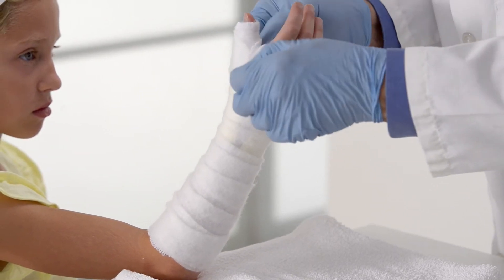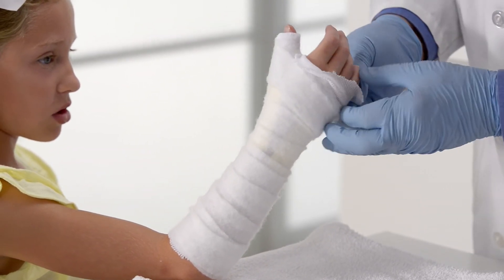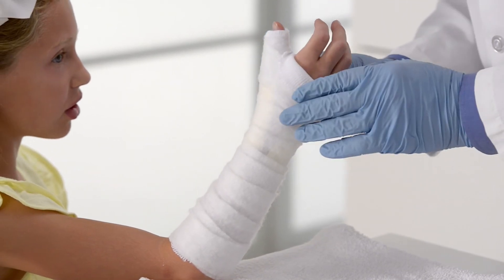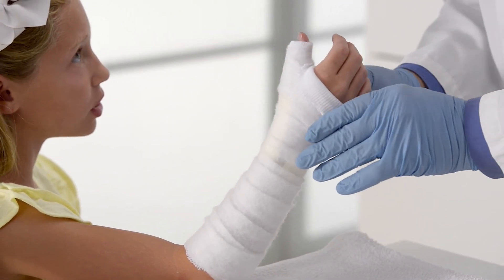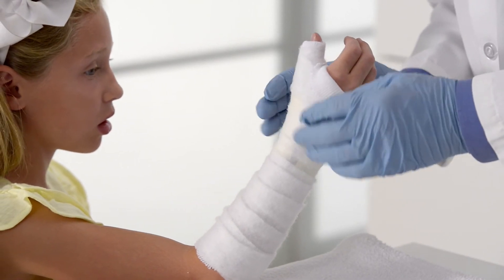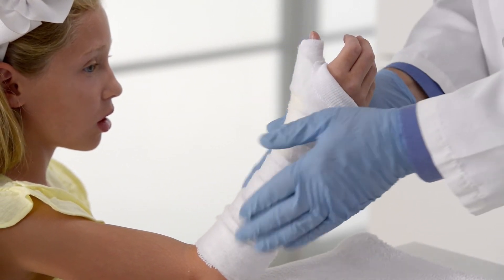Fold the stockinette back over the padding at the distal palmar crease. Confirm that the patient's arm is in the proper position. The wrist should be neutral, while the index finger and thumb should be in opposition, allowing for functional hand movements.